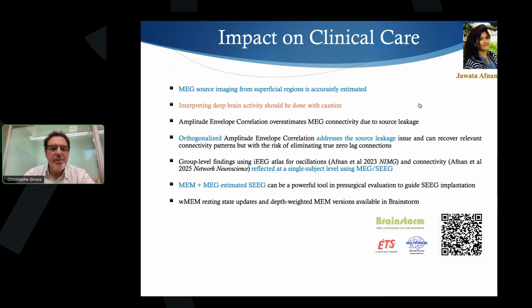And I would be more in favor of things like that than having more of a 3D grid where dipoles are allowed in any direction. I know it's a question of choice. Probably there are pros and cons in doing that. That's mainly what we have been doing, and we show that this is serious information that has been taken into account, and you can also use model comparison to show that when the anatomy of the subject is taken into account, there is information that the model is using. So I think it is important.